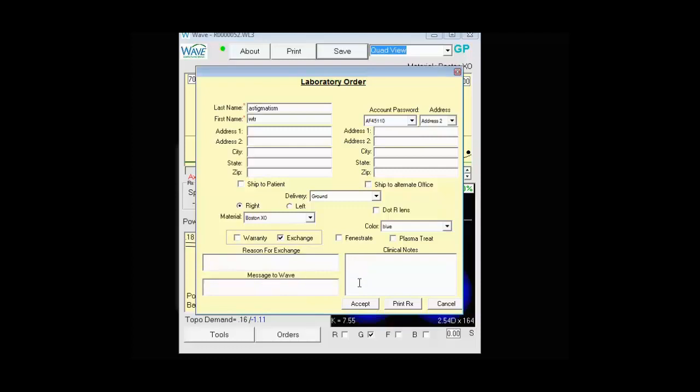And if you have any clinical notes, this is for your own reference. So if you've edited a lens, altered it, and you want to just keep note of what you're doing, that's what this box is for. You can hit Accept. Print Rx will allow you to give a printout to your patient so they can keep a record for their contact lenses. And then Cancel.